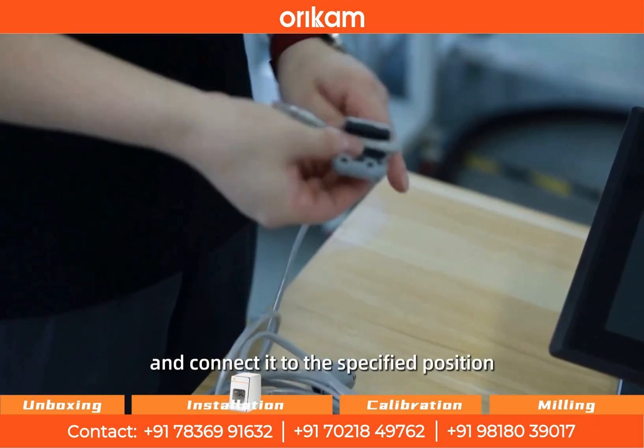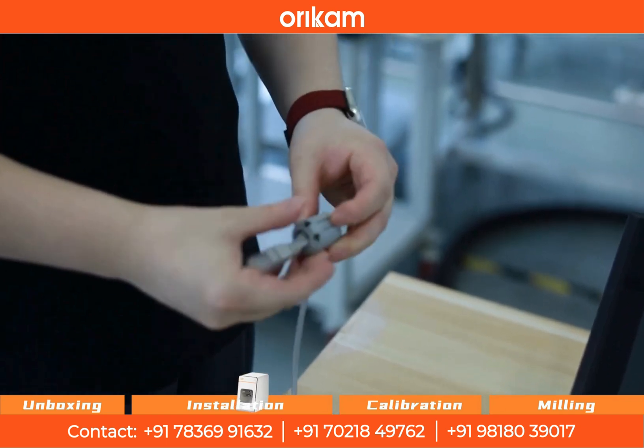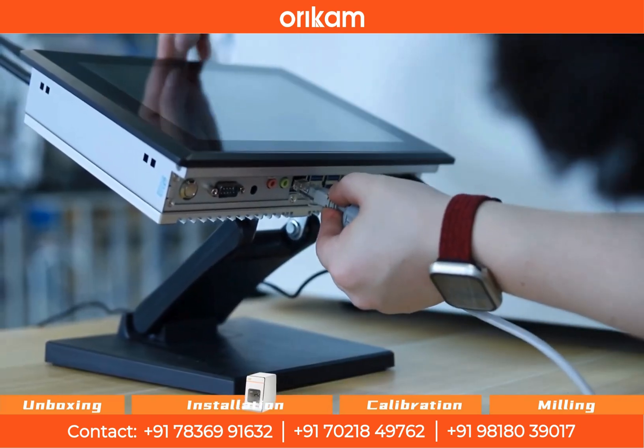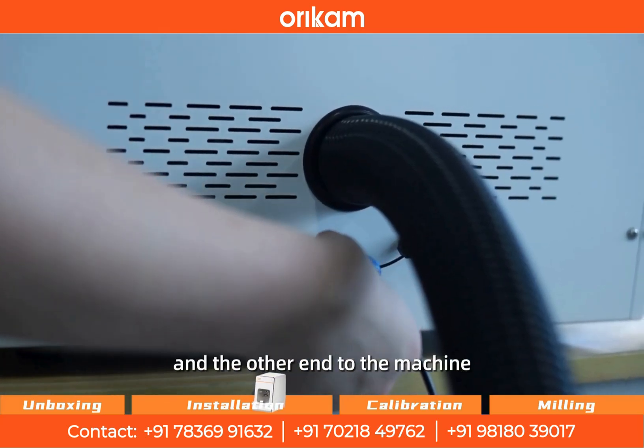Take out the network cable and connect it to the specified position. Connect the computer to the machine, with one end going to the computer and the other end to the machine.